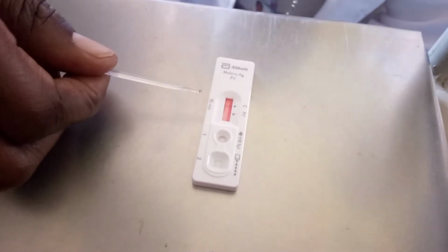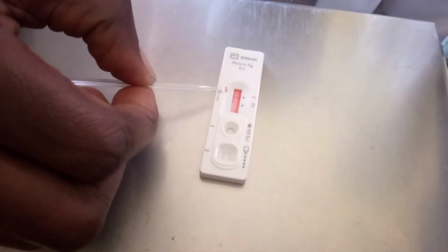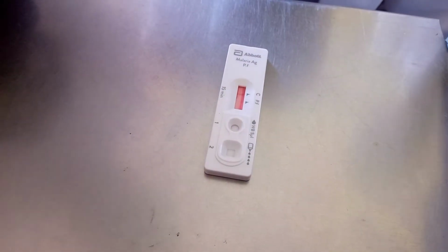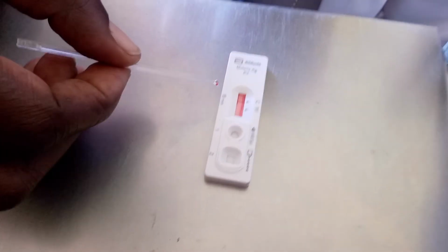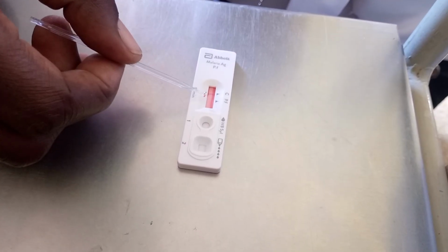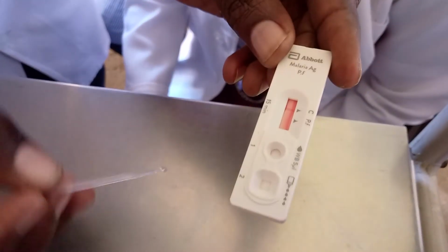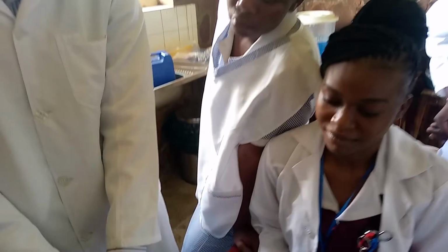So at this moment, as you can see here, the line for control is visible, but for PF, it's not visible. So this reading will show you that this is a negative malaria test. So if you saw 2 lines, like this line on the control, if it were to appear here on the PF, it would mean that falciparum malaria is positive. Okay, so in this case, there is no line here. Okay, so it's negative. So Lydia, as you can see, you don't have malaria.